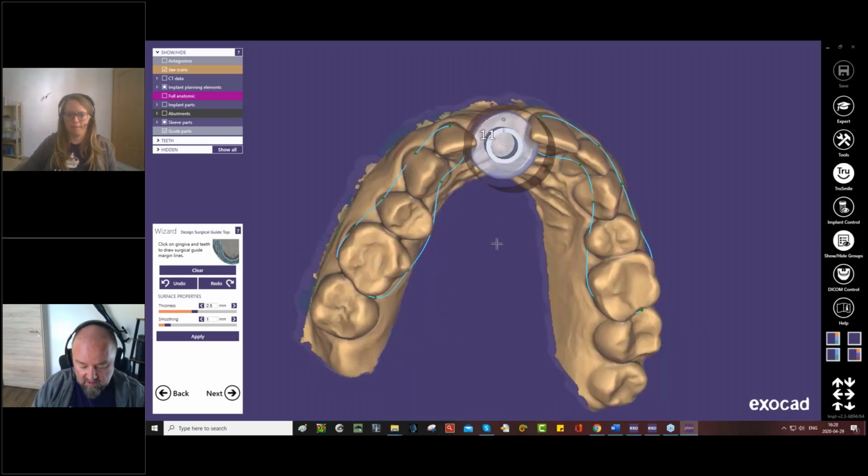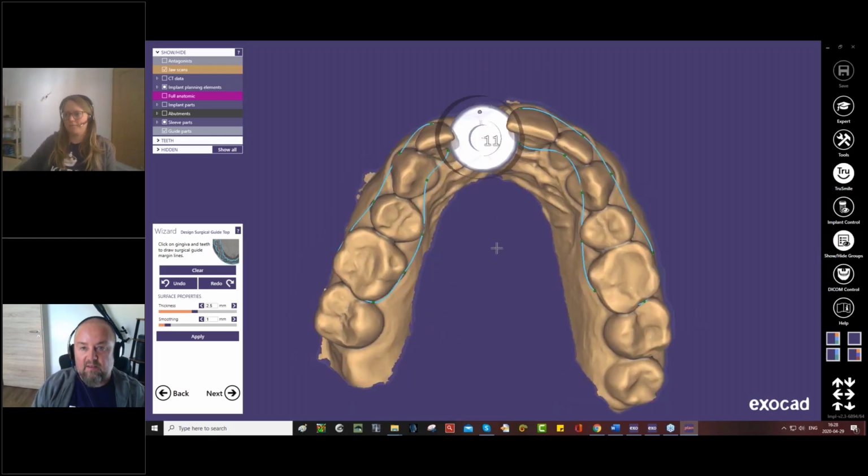Yes? So, sorry to interrupt you. No problem. There's an interesting question which I was not really able to answer. I guess there's maybe a workaround, or maybe there's an official feature. In case you are working with multiple implants, is it possible to create two guides, one after another?